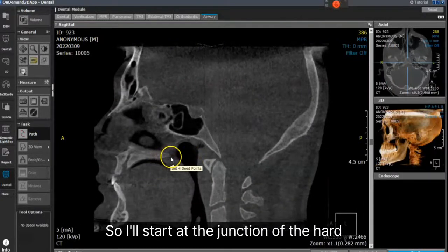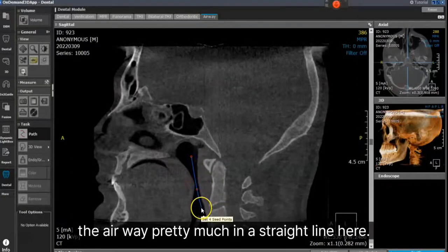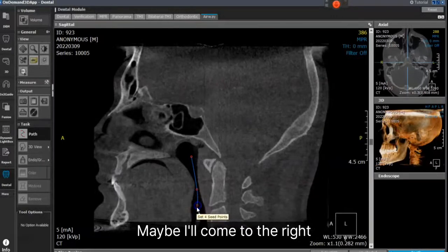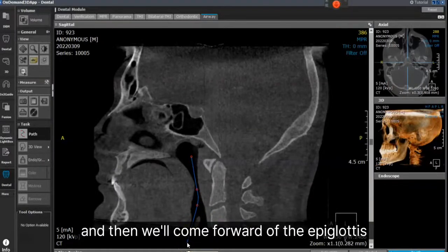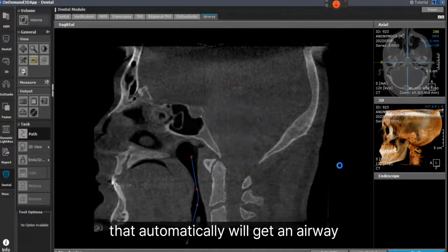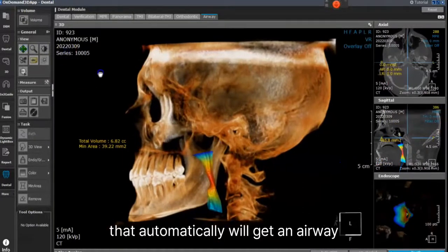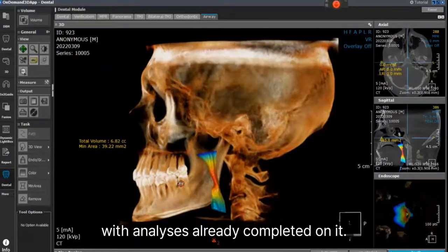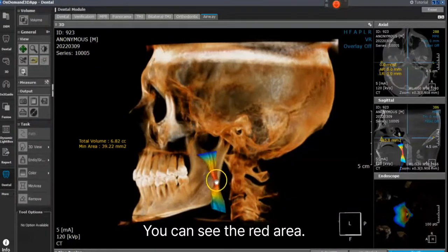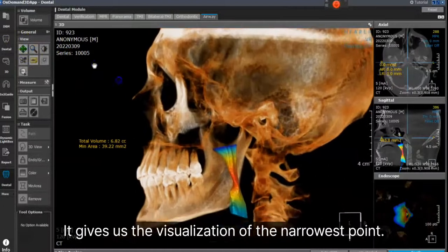I'll start at the junction of the hard and soft palate. I'll go down the airway pretty much in a straight line. Maybe I'll come to the right, and then we'll come forward of the epiglottis and double-click. You'll see that automatically we'll get an airway with analyses already completed on it, and you can see the red area gives us the visualization of the narrowest point.